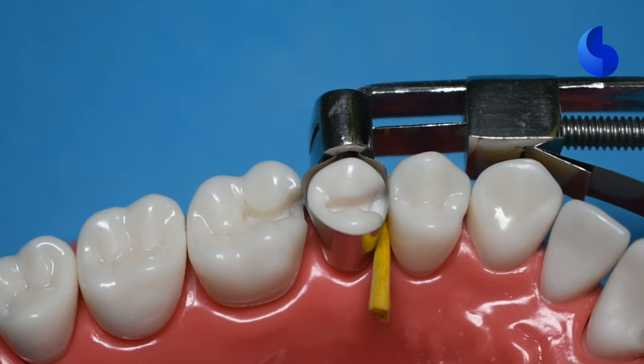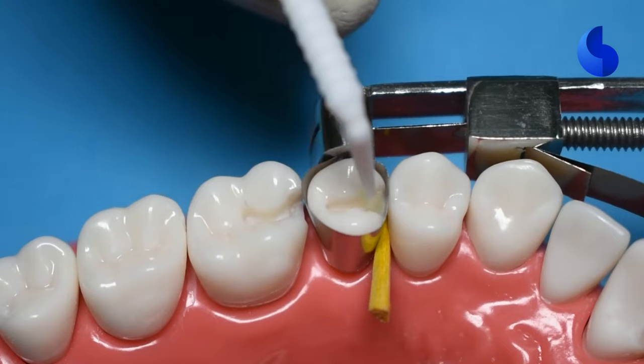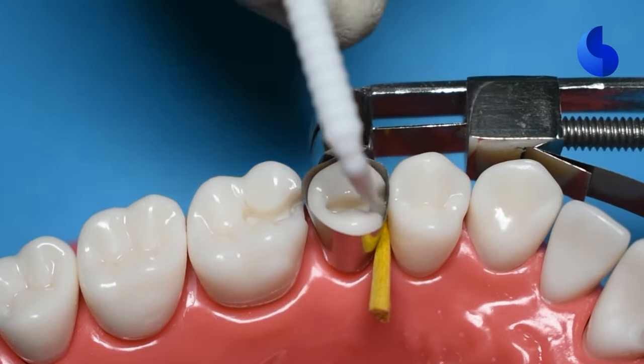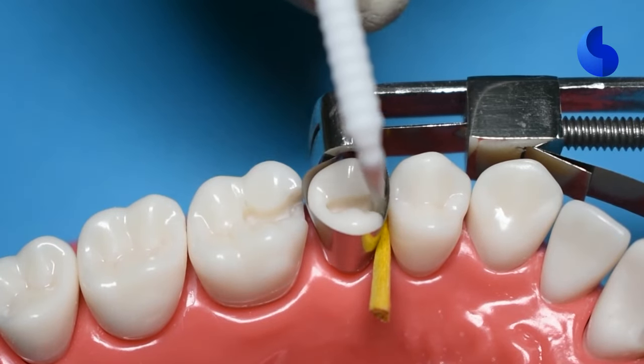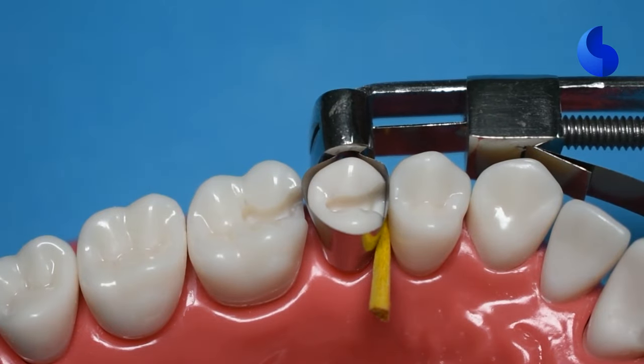So we have our wedge in place, we have a Tofflemire matrix band. As you can see, there is no gap in our proximal box. It's completely sealed off, so a wedge is super essential to use over here. You can use any other system, a segmental matrix system, an Auto Matrix, whatever it is. Make sure that it's completely sealed off and you don't see a gap in the proximal box.